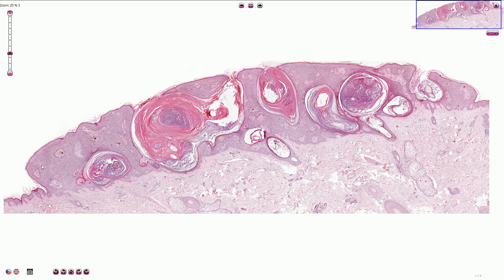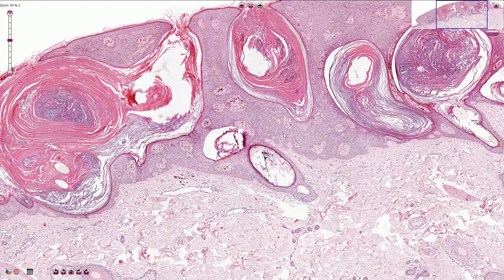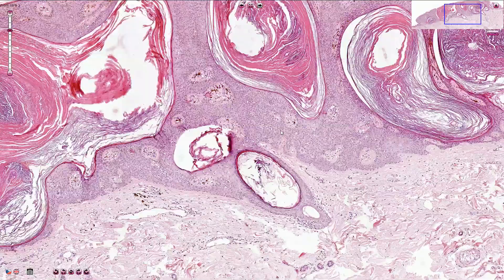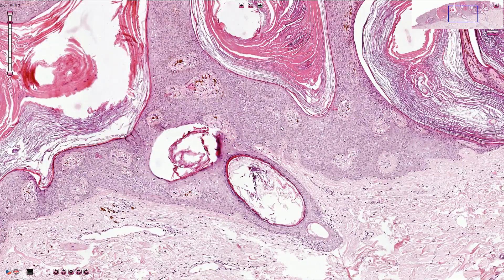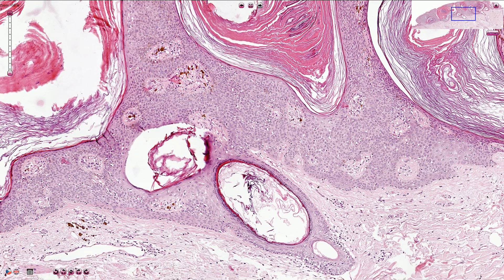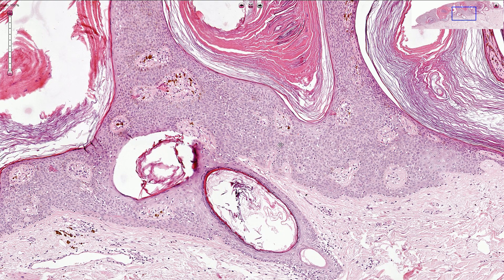The surface is usually smooth, and the acanthotic epidermis does not protrude into the deeper layers of the dermis — that is quite characteristic. The cells are bland with no mitotic figures and without any atypia.